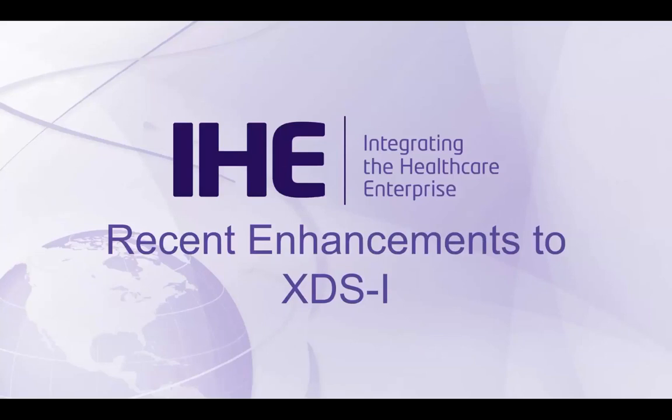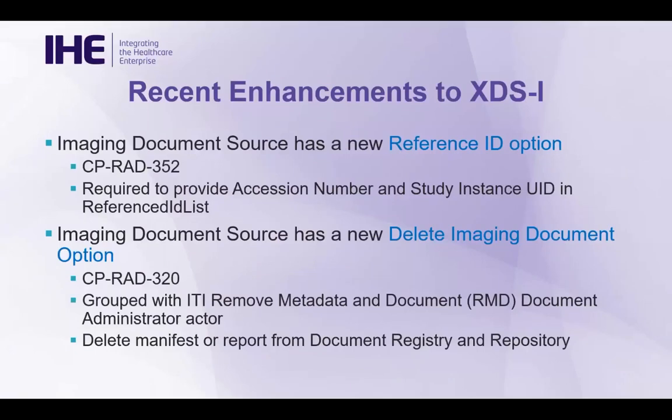It is about XDS-I. There are some recent enhancements to XDS-I. I know many of you implemented this integration profile. It's been one of the great successes recently in radiology. Because of the heavy use of this profile in many different regions, we get lots of feedback, and there are a number of enhancements that we made recently that I would like to highlight today.